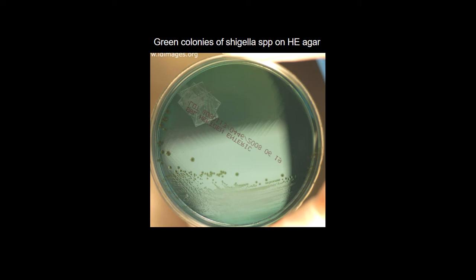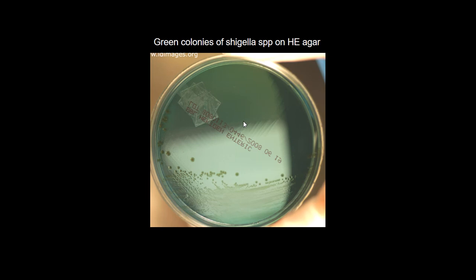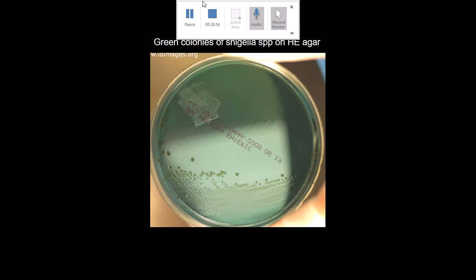And that makes the pathogens here. For example, with the media that we use, Hektoen enteric, we can pick up the green colonies for Shigella. And we then ignore the lactose fermenting colonies. So the non-fermenters usually are the ones that we are concerned with.